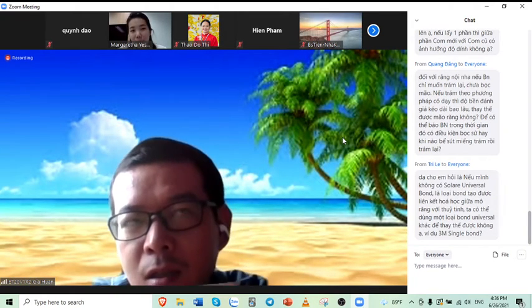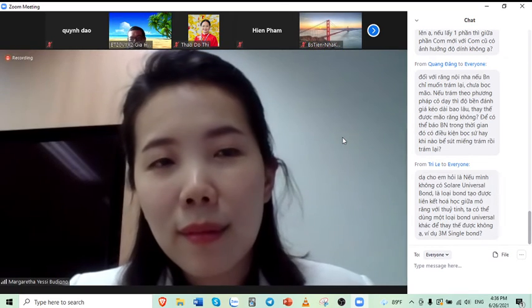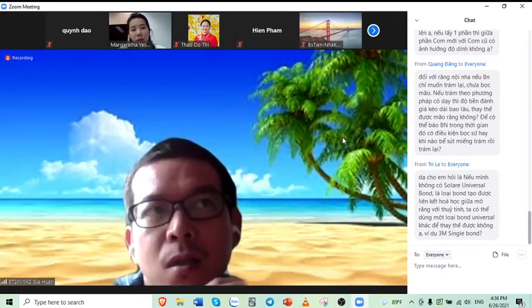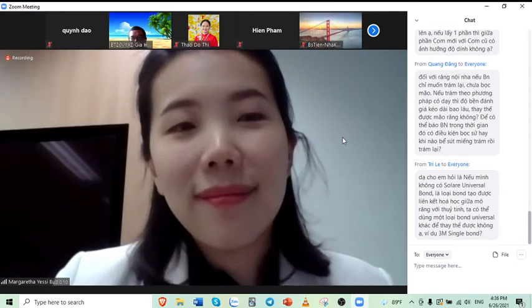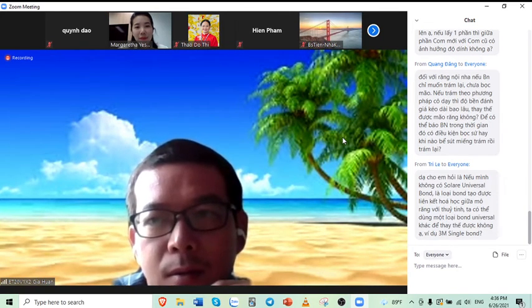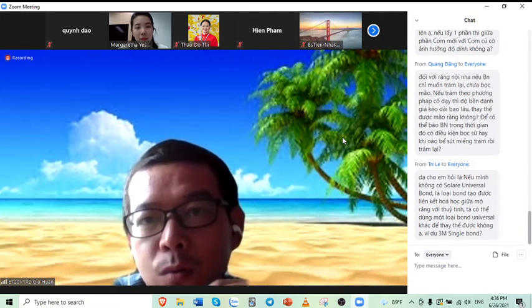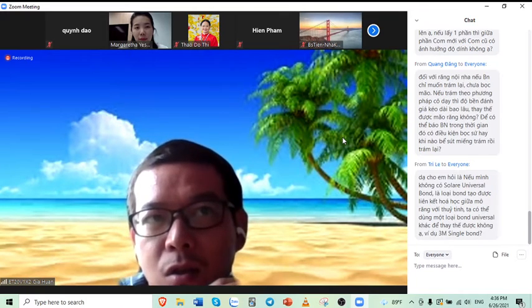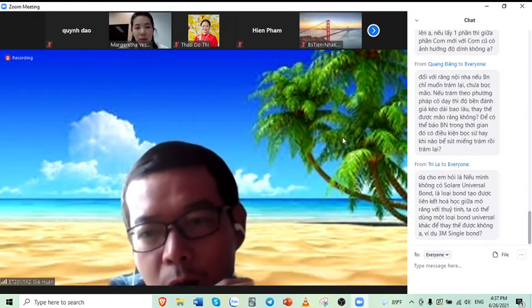So in this case the tooth has a root canal treatment and a large cavity, and the patient doesn't have the condition to restore it with a crown. So the technique you use with the composite, can it compare with the crown in restoring the tooth? That means it can tolerate the chewing force. Can it stay in the mouth for a long time like a crown?